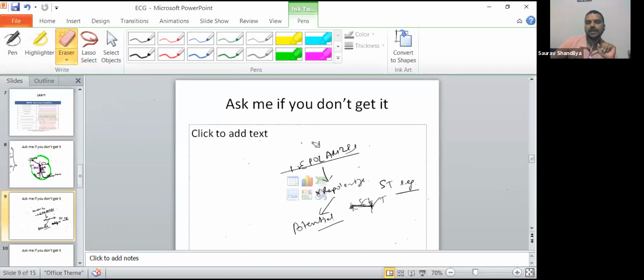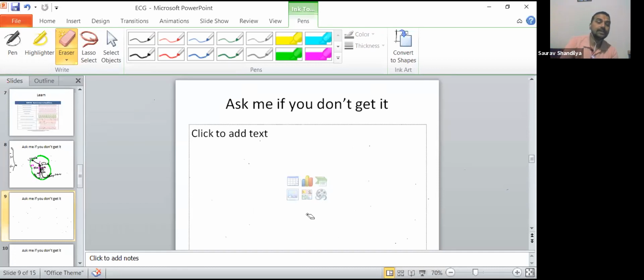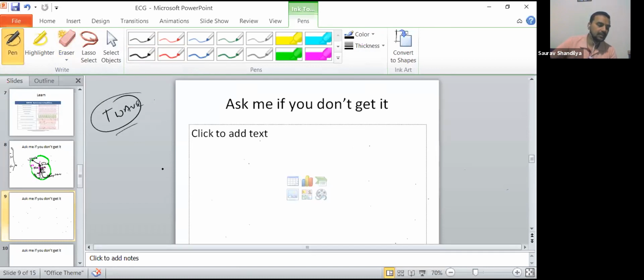So T wave is what? As you have understood from the first slide or maybe the third slide itself, the T wave is nothing. It's a ventricular repolarization. It is equally very, very important because T wave gives us a lot of idea about it. Okay, T wave is what? Entire ventricle is getting repolarized. Either it's a left ventricle or right ventricle, it is getting repolarized.